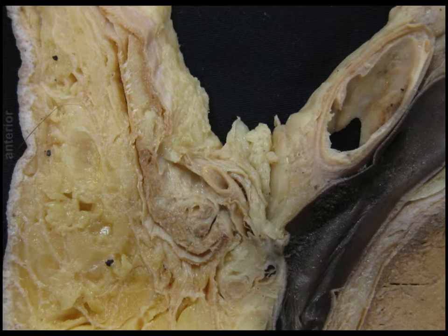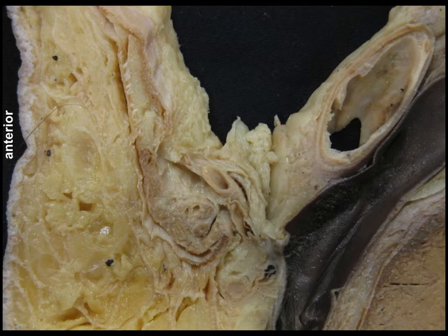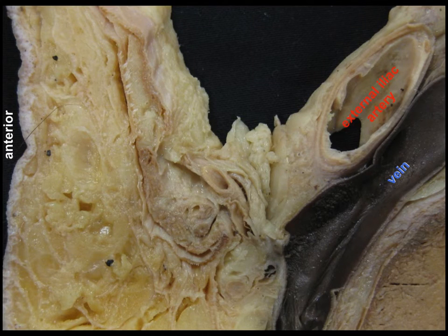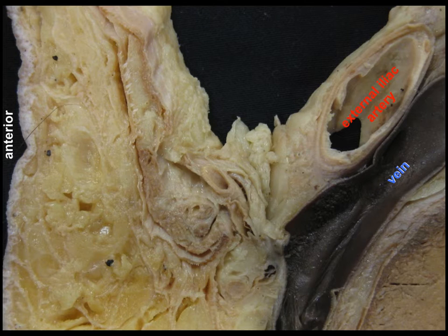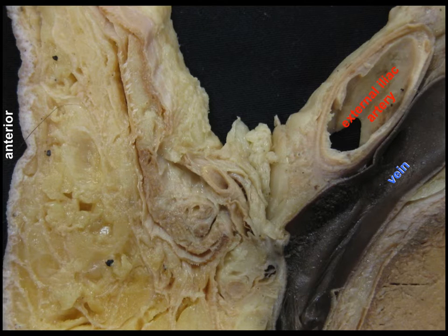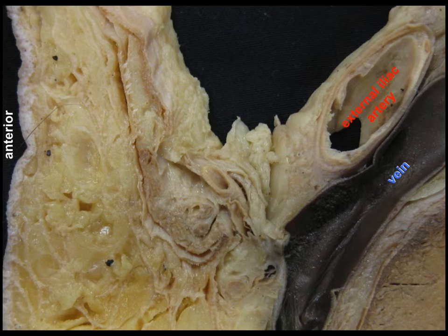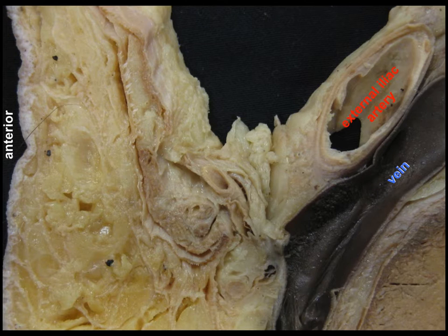This is a sagittal section. This is anterior, this is posterior, through the inguinal canal and right at the level of the external iliac vessels. This is the external iliac artery and external iliac vein. The more anterior and caudal you go, it will transform into the femoral vessels. This will be our orientation level when we demonstrate our block and when we demonstrate transducer position.